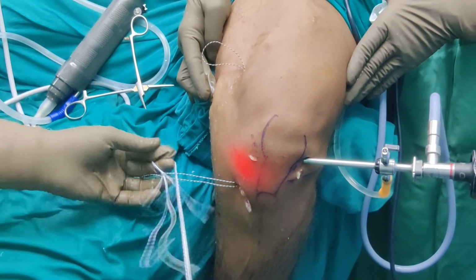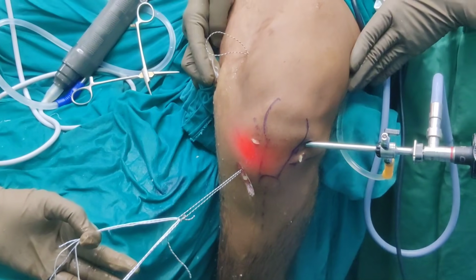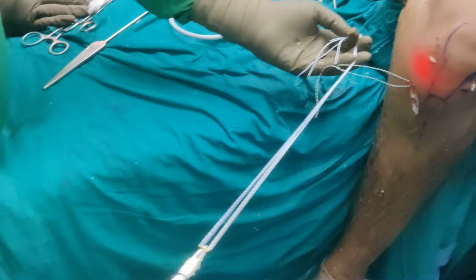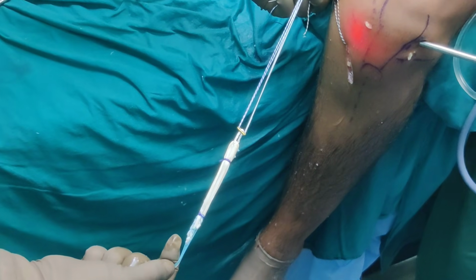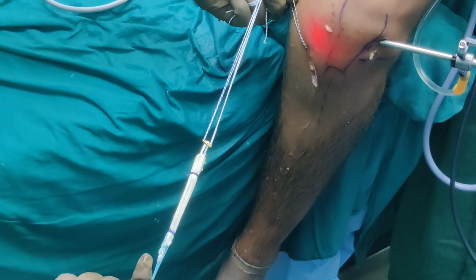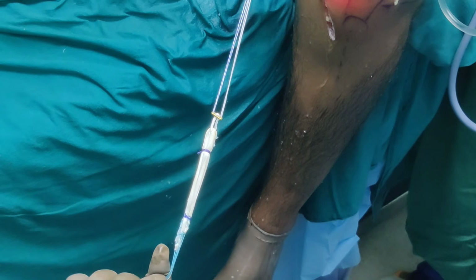This is our graft. Now Manish is our main person. He prepares the graft. Look at how beautifully he has prepared the graft. So in India you have this luxury that you have got this really talented assistant who will do graft preparation for you. In England you have to do it yourself. So beautiful graft ready to go in.